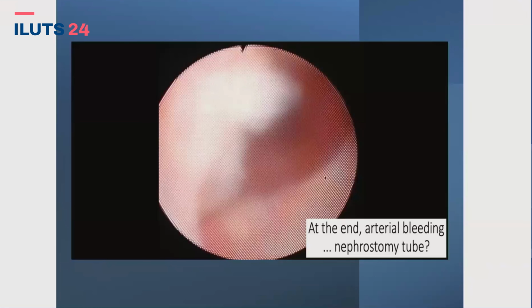Okay. I don't think it's an important vessel. When you have an important vessel, you don't see anything. The thing is the magnification. Well, you see the vessel, and if you can, coagulate. But I don't think that vessel is going to give any problem to the surgery, in my opinion. So I ask the auditorium, who's looking at the tract when you finish PCNL?